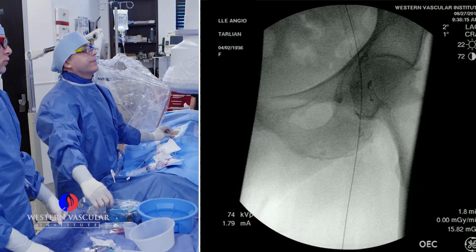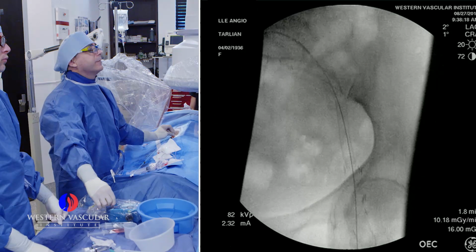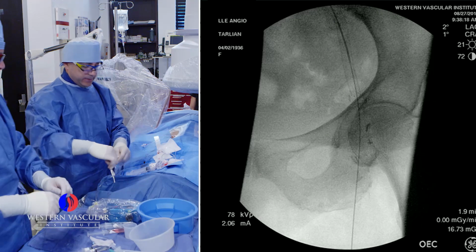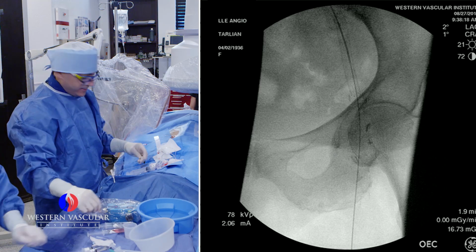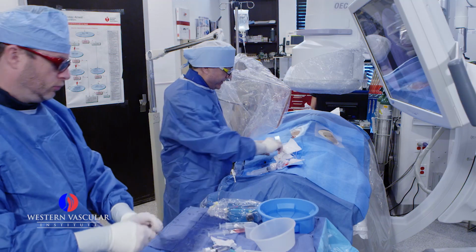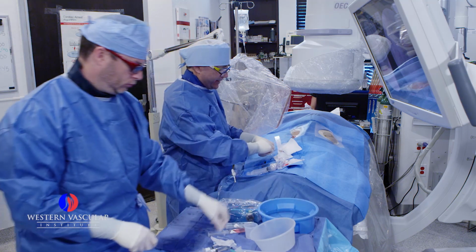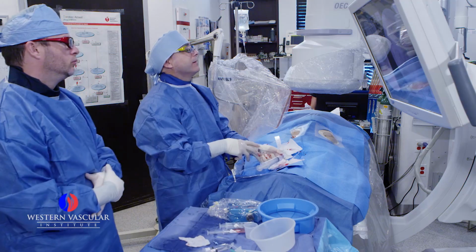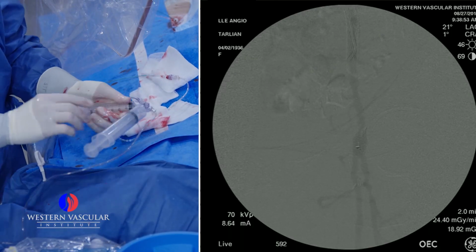The images that you get from carbon dioxide, live please, are not always as good as the images you get from dye. And therefore we tend to use dye. The images are much better. When we do carbon dioxide below the knee, the images that we have aren't really all that clear, and you kind of lose the benefits of carbon dioxide below the knee. Do a shot here. And there you can see a nice image.